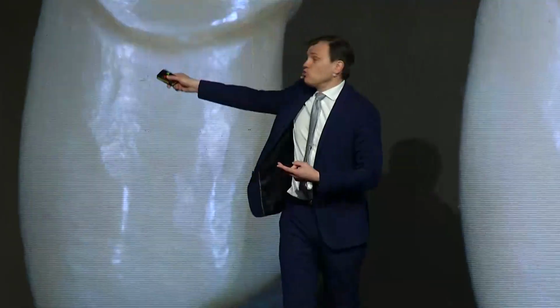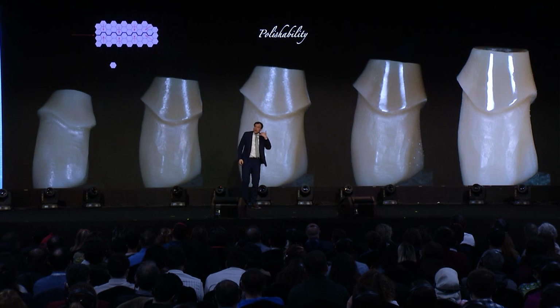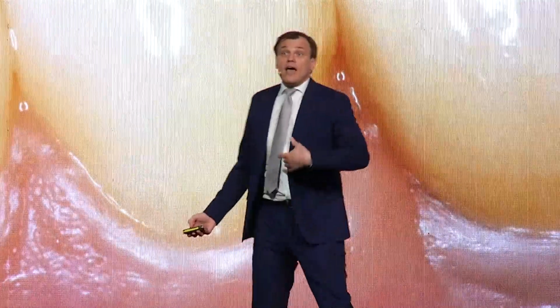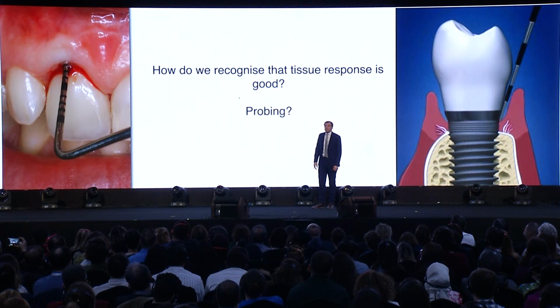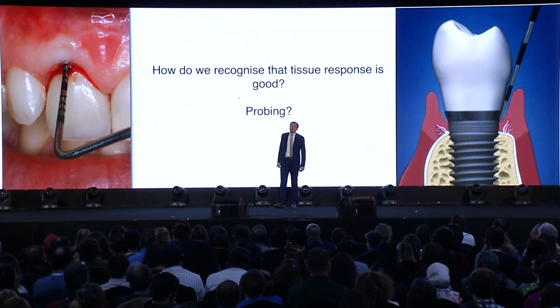When you ask a clinician to polish zirconia, after 1 week you will get the call, doc, we need to talk about money, because it takes more time and it's more difficult. So there must be really a reason why I want super polished zirconia. I will just jump ahead and say that I have been using super polished zirconia for 8 years or even more, and I have only good observations. Some of them I'm going to show you now.